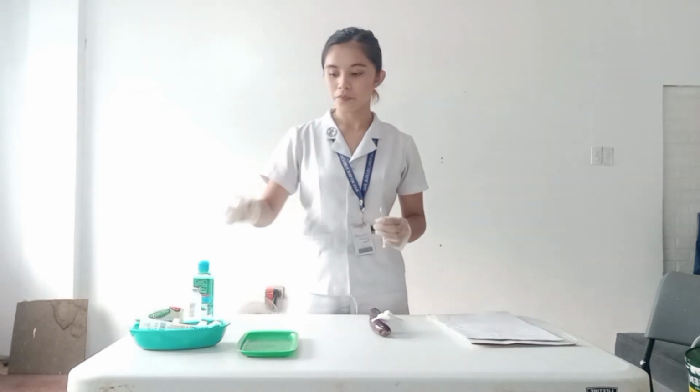Now I have to remove the needle cap while waiting for the antiseptic to dry. I have to pull the cap straight off to avoid contaminating the needle by the outside edge of the cap. Now I have to grasp the syringe in my dominant hand by holding it between my thumb and my fingers, with the palm facing on the side or upward for a 45 degrees angle insertion, or with the palm downward for a 90 degrees angle insertion. This is to prepare to inject.